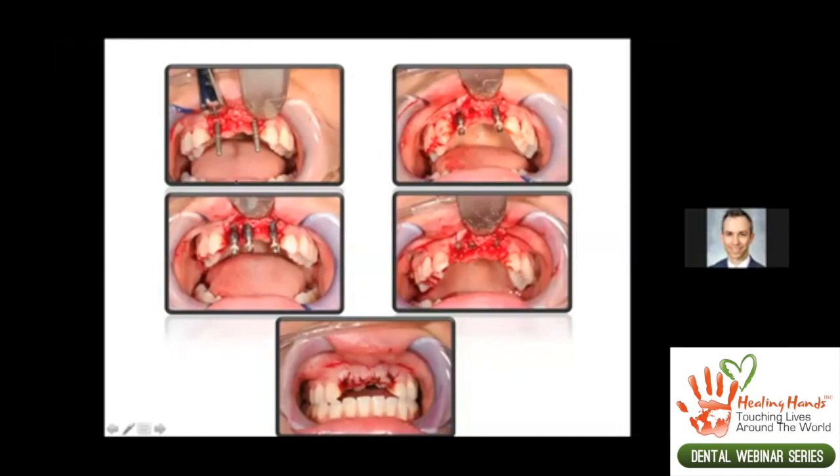I would say that probably these 2 implants are a little too close for my preference, but this was restoratively guided based on the position of the teeth. But you want to maintain adequate space there for blood supply, so you can maintain your papilla and maintain your inner implant bone there. 2 millimeters is the very, very bare minimum, but 3 millimeters is the ideal minimum.